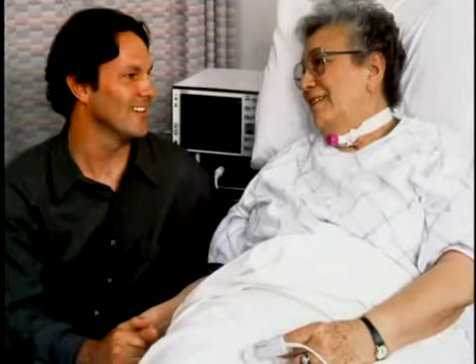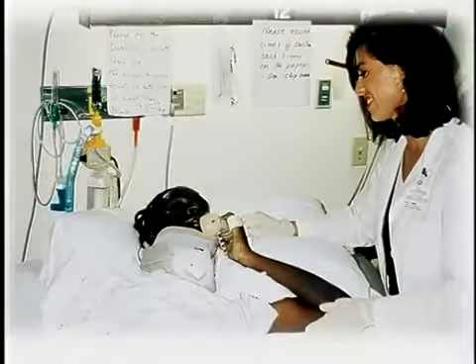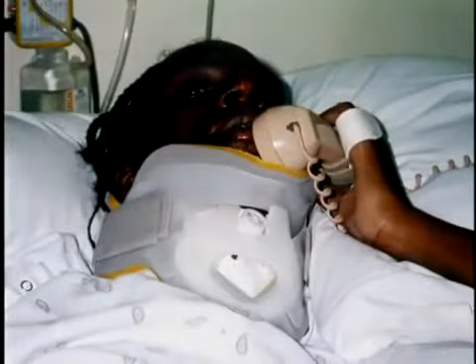Often, ventilator-dependent patients experience depression and may not want to participate in therapy or conversation. Solicitation of family involvement and psychological intervention may be necessary. Using the Passy-Muir valve during family, doctor, and therapy visits or telephone conversations may motivate the patient to participate more actively with their care. With this increased autonomy, depression may be improved.